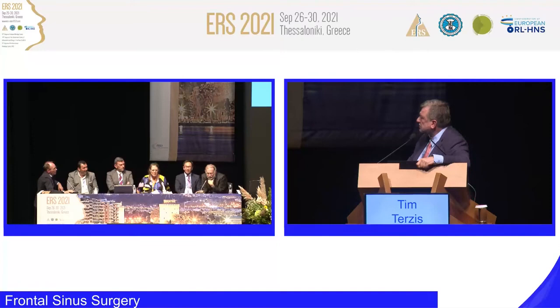At the beginning, we thought about an infectious process, because there was resolution after antibiotics, but then we had a relapse. And here there is no pathology in the pathway of the frontal sinus. There is no ethmoiditis, so, of course, no infectious disease. We can see hypertrophy of the mucosa and maybe osteomyelitis on the anterior and posterior wall of the frontal.